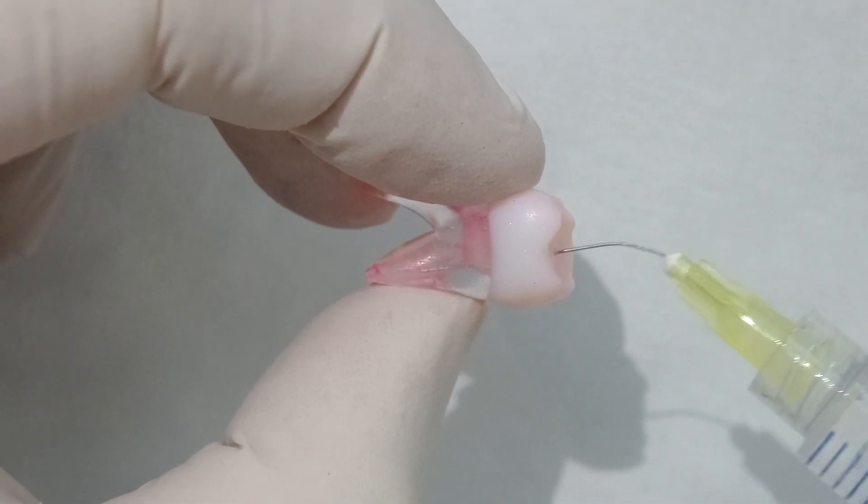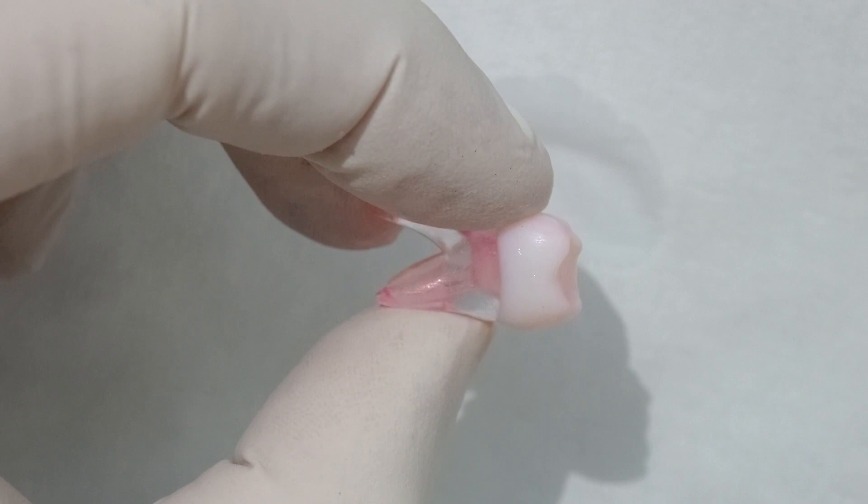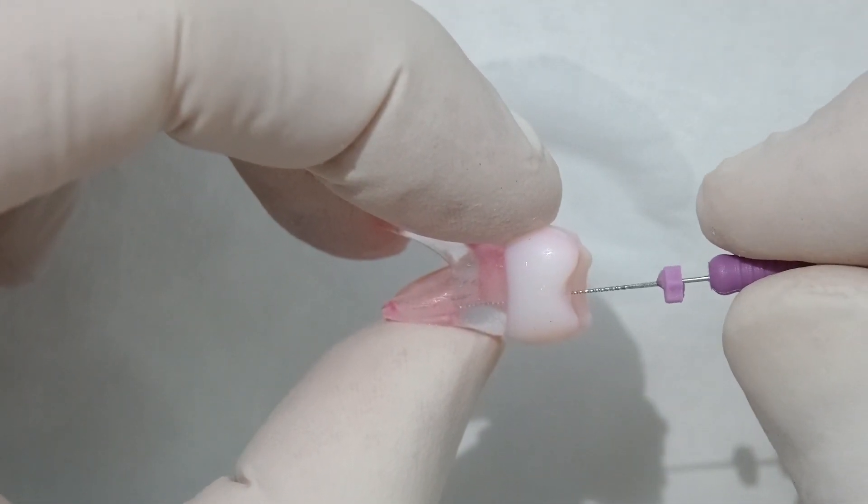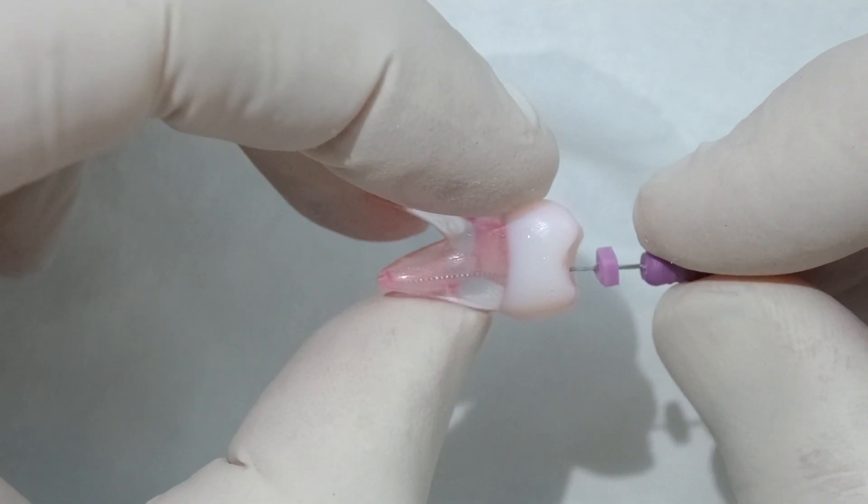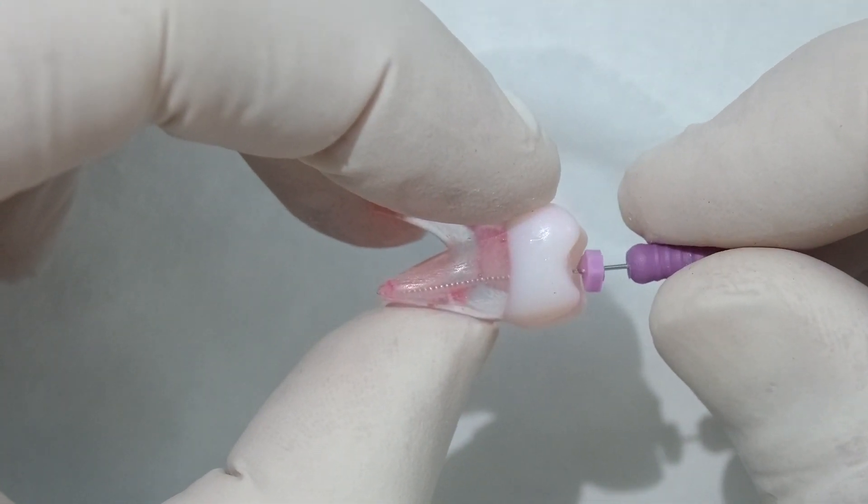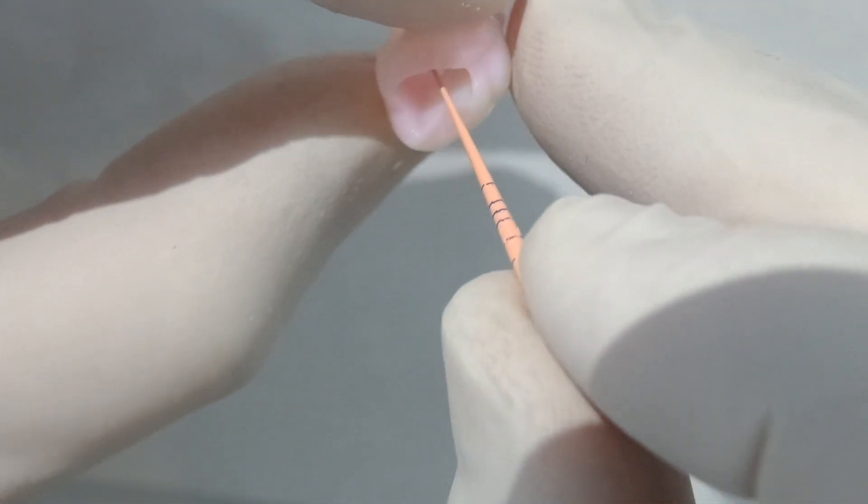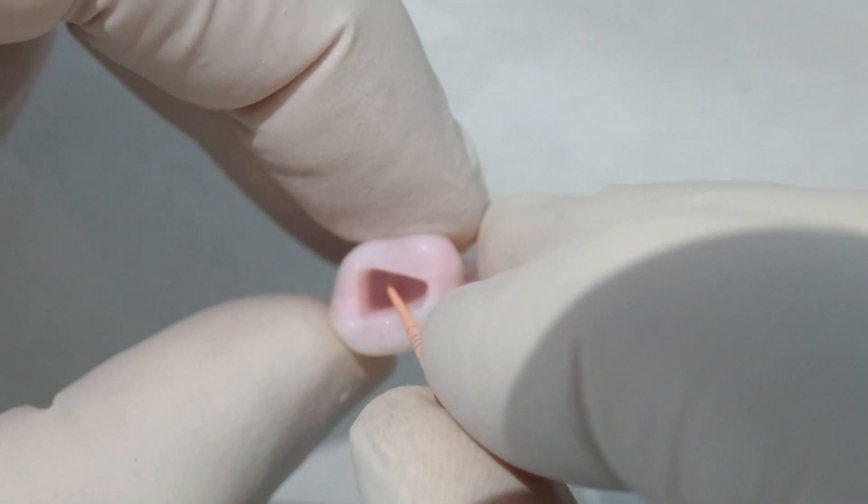Again, nice bit of irrigation. We'll go back in with our patency file. Just check that that's still patent. You need to make sure that we're always irrigating. Lots and lots of irrigant. You can't over irrigate. Keep that needle of that irrigant in the top third. Keep it moving. Don't let it bind.